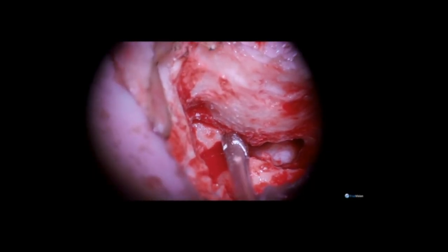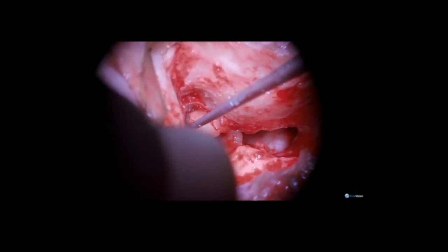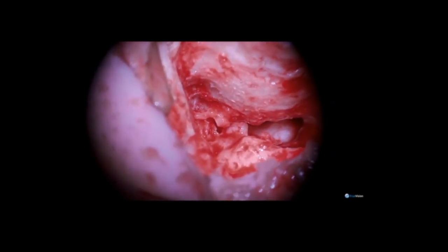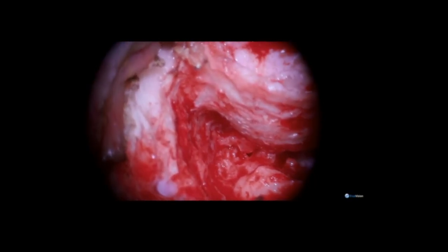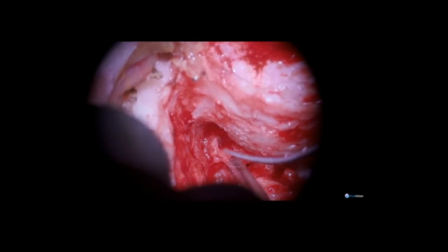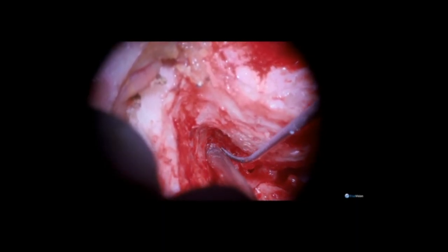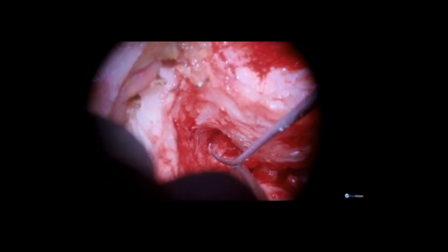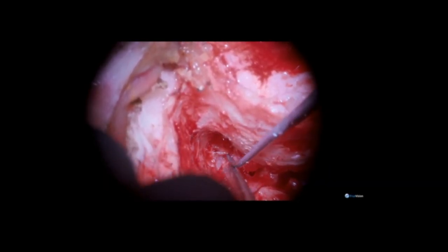The head of the malleus is blocking access to the remainder of the cholesteatoma, so it needs to be removed. I will complete as much of the dissection through this route prior to opening and entering through the external auditory canal skin, and then work in a combined transmastoid and transcanal fashion to ensure complete resection of the cholesteatoma.